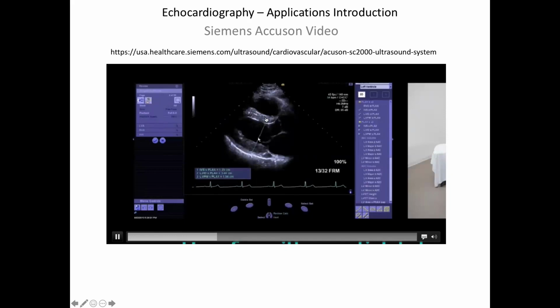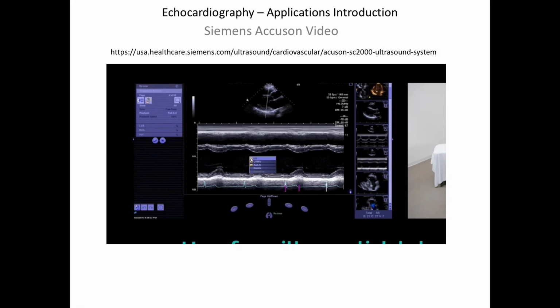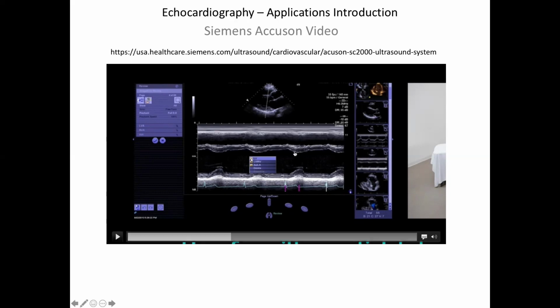I think we'll probably go into, so there's some more geometry, and then given that line that you have defined with the geometry, you can then flip into M mode, and you can measure these dynamics of the wall and how it's contracting. You can imagine that not only the total dimension of how much ejection is occurring, like how one wall is moving away from the transducer, one's moving towards, how much is occurring.